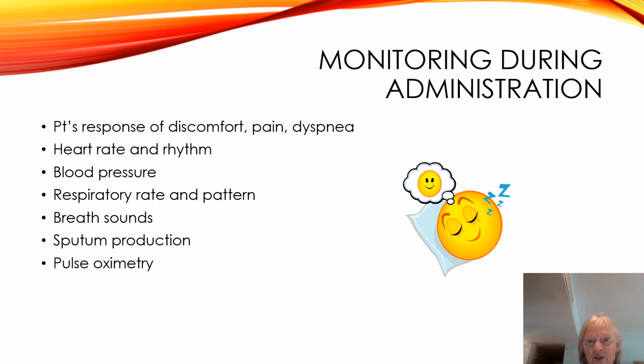Have they gotten better at this particular point? If they have gotten better, then we have done something good. At the end of all our aerosol treatments, the one thing you have to ask this patient to do is cough. You've just relaxed the airways. You need to make sure they can cough. Sometimes they have a dry cough. Sometimes these patients are going to tell you they're not coughing anything up, and they never cough anything up, and that is okay. That is not a problem, but you still have to have them cough. The number one mistake students make is they don't have their patients cough.